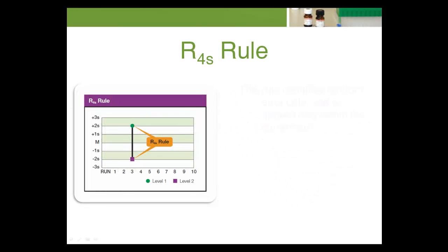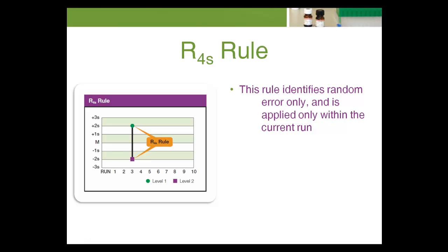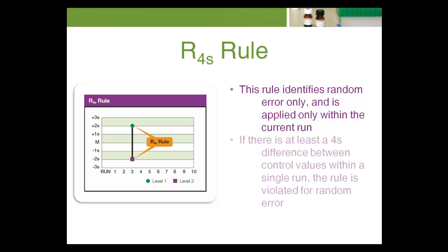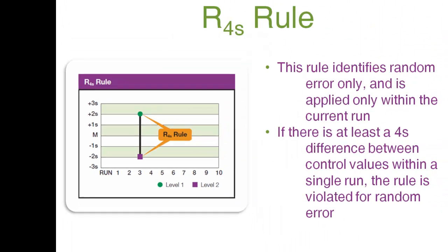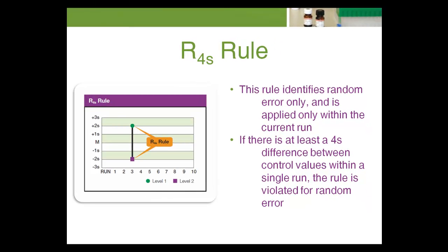The R4s rule identifies random error only and is applied only within the current run. If there is at least a 4s difference between control values within a single run, the rule is violated for random error. For example, assume both level 1 and level 2 have been assayed within the current run. Level 1 is positive 2.8s above the mean, and level 2 is negative 1.3s below the mean. The total difference between the two control levels is greater than 4s — e.g., plus 2.8s minus negative 1.3s equals 4.1s.